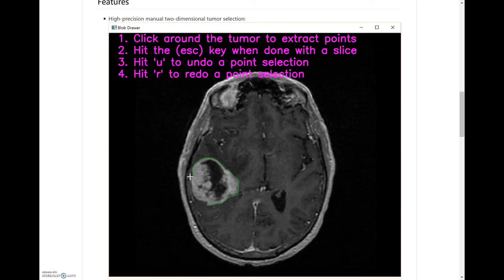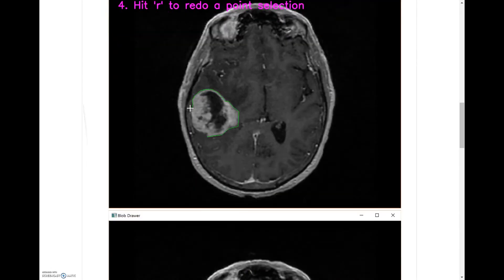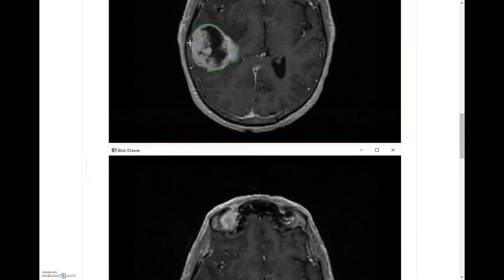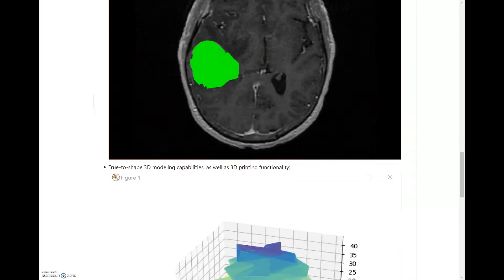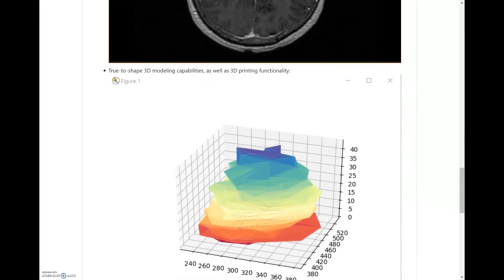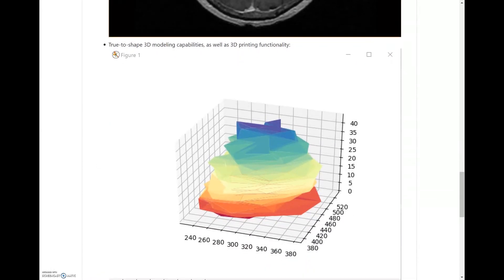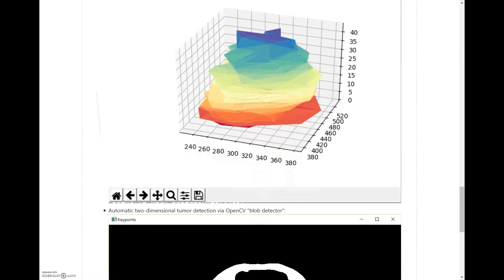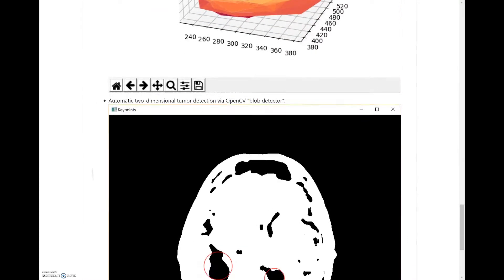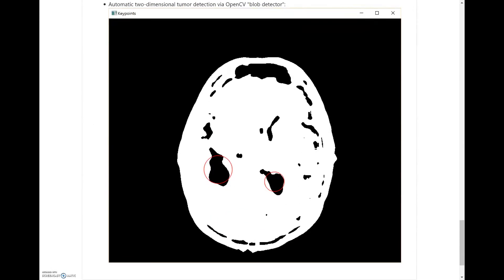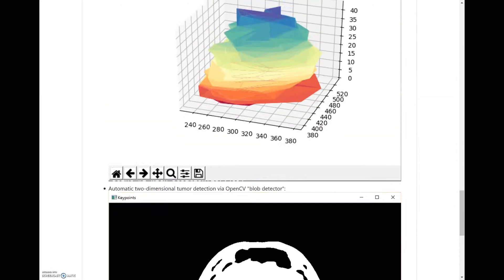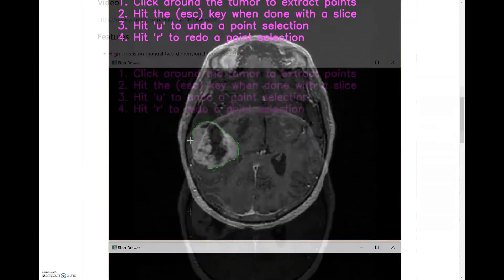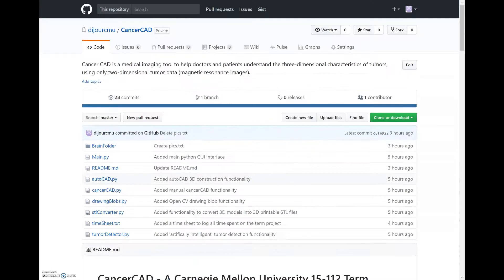The main features of this program are polygon drawing over cancer images, where a doctor would go in and use this program to draw a polygon over every slice of cancer, and then that gets built up in 3D, as you can see by this multicolored graph. Additionally, the program has intelligent cancer detection, which uses OpenCV's blob detector to find the cancer by itself and then extract the coordinates.